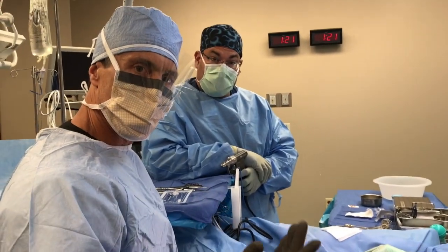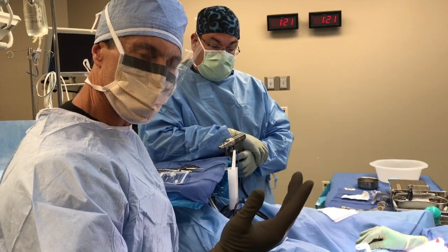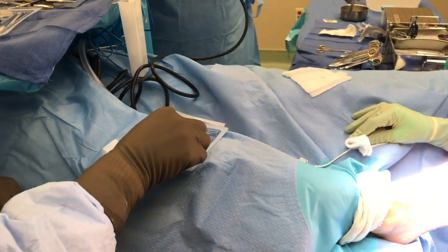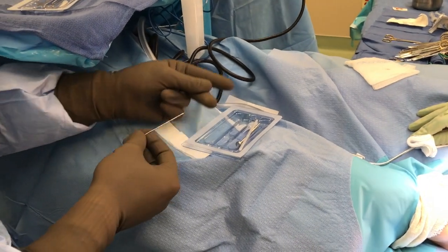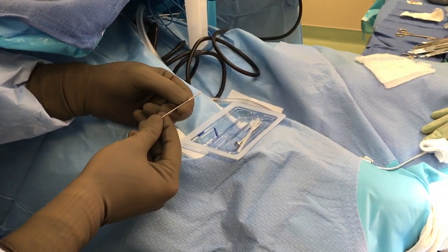The equipment we're going to use to keep the toe straight is called the Trim-It pin. There are two sizes. The 1.5 — you start with the K-wire, and this has some hatch marks on it so you know how far you're drilling down the toe.